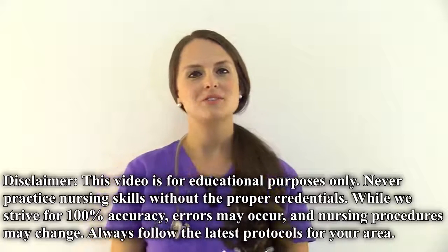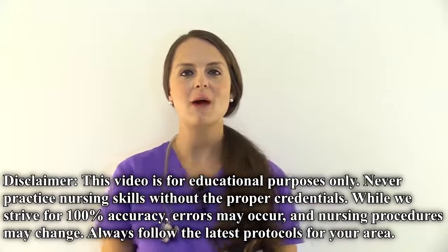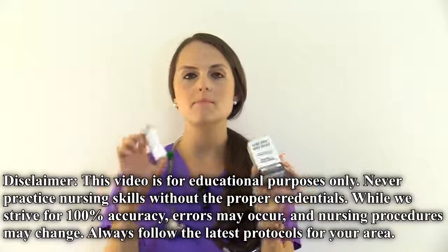Hey everyone, it's Sarah with RegisteredNurseRN.com, and in this video I'm going to demonstrate for you how to use a metered dose inhaler using both the open mouth and closed mouth technique.